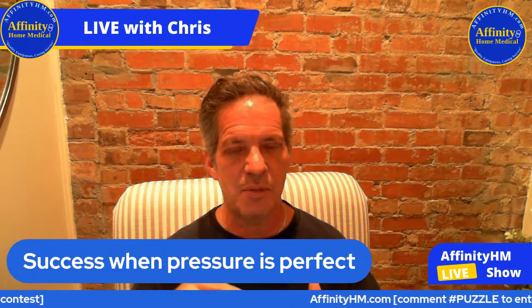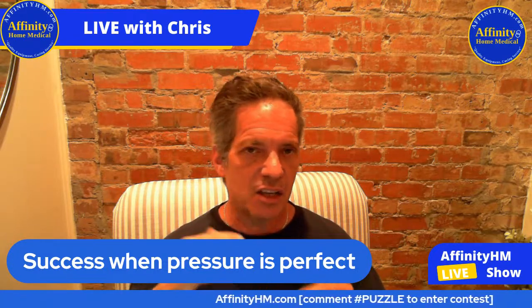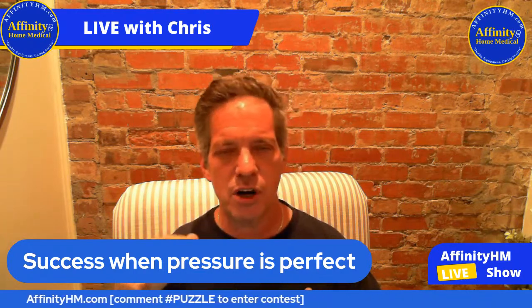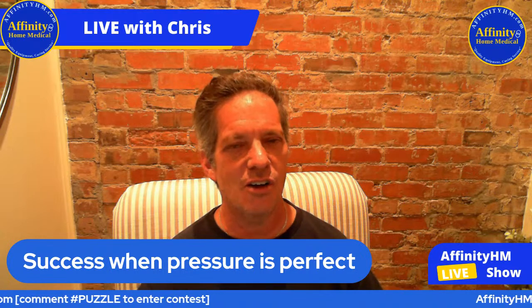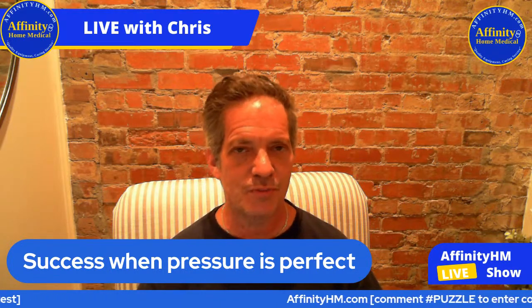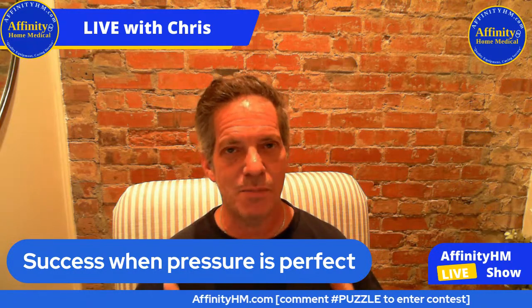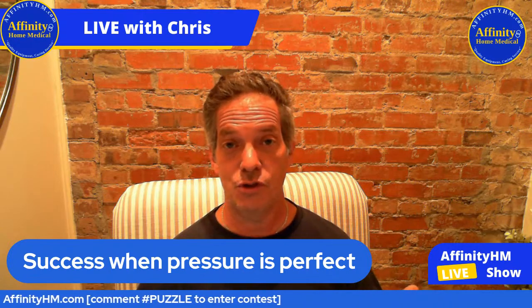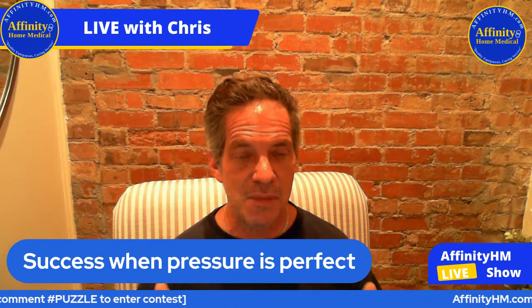Possibly it's going to run at the low pressure, you have apneas, and it's jumping all around, changing the pressure. And guess what that is causing in many cases? Arousals. It's causing people to awaken because of the pressure changes. So it's sort of shooting yourself in the foot a little bit in many cases.